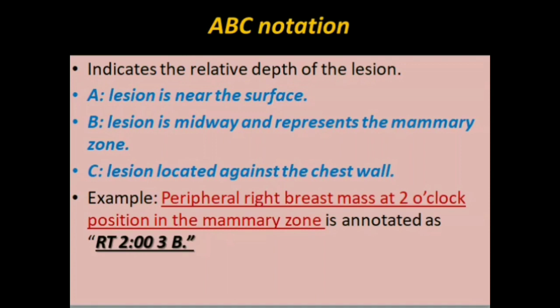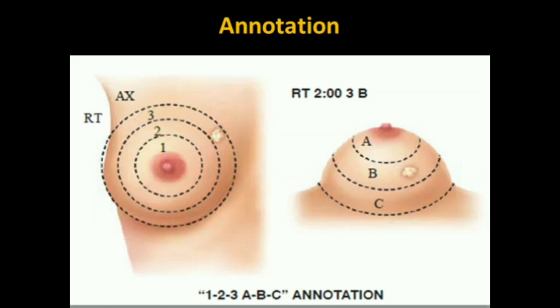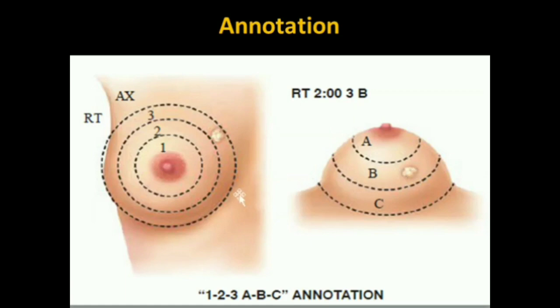3 shows the outer ring and 2 o'clock shows the position in the ring. In this slide we see two images. The first image shows the rings — the inner, middle, and outer rings — and also the axillary region. A lesion which lies posterior or in the retro-mammary zone will be labeled as X. In this image we can see a lesion that clearly lies in the outer ring at 2 o'clock, and from this image we can see the lesion is confined to the middle zone, or B. So it was labeled as a right 2 o'clock 3B lesion.